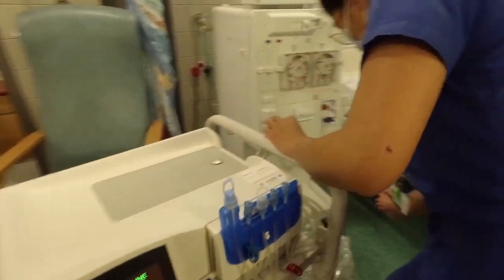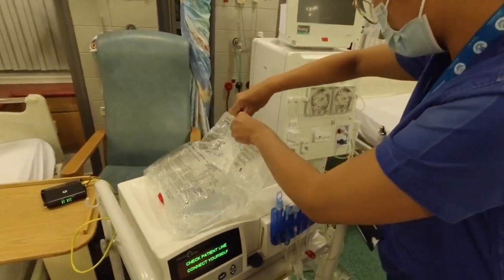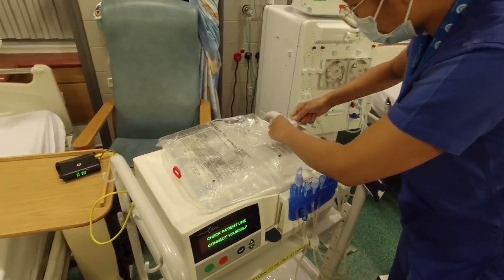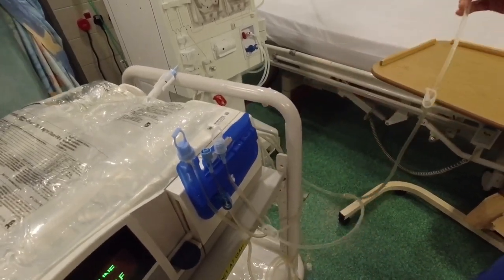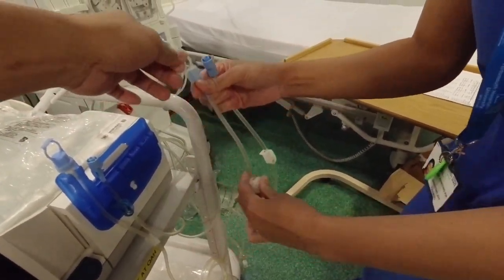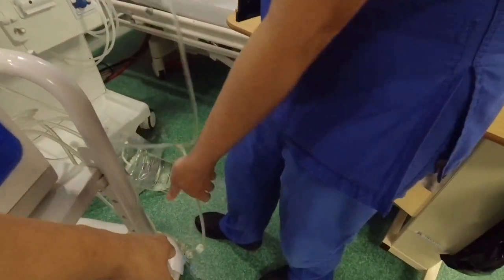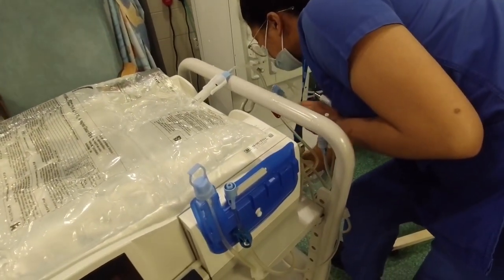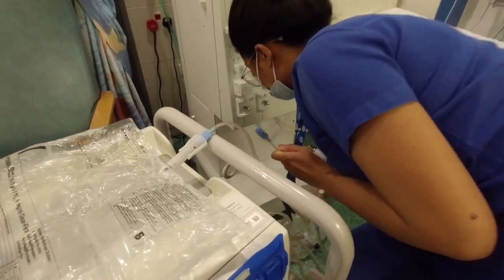Saan na yung kanina sa taas? Yan, yun. Pwede na yun. Nasa harapan mo. Alright. Okay. And then this one, saan nga ba to? Dalawa siya, so clamp tong isa, hindi ko kailangan. Tama ba? Ay, hindi. This is the ano. Ito yung hindi ko kailangan. So just hang it in there. Hang it here. Yung hindi mo kailangan. Yan. Tapos, yung isa ko pang bag. That's it.